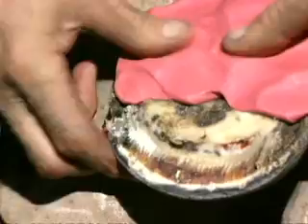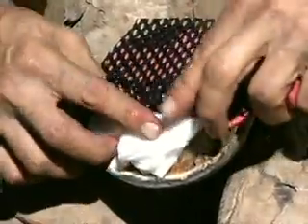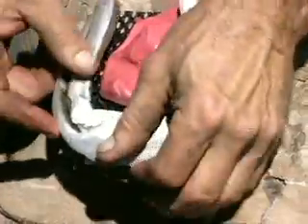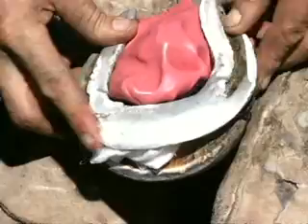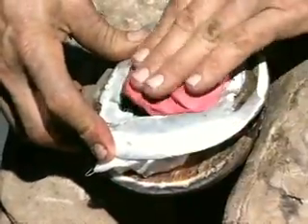I will apply the advanced cushion, being very careful not to let it run forward because I do not want the advanced cushion to be sitting over this area. I'll place a little gauze in just to make sure that the cushion does not migrate too far forward. Hold the screen back, place the shoe on, anchor the shoe. I'll let the cushion go slightly underneath.